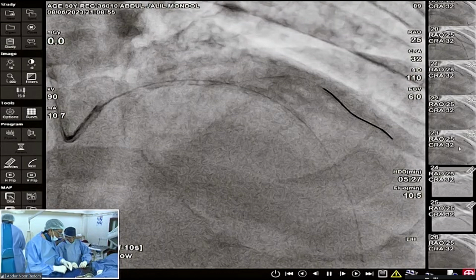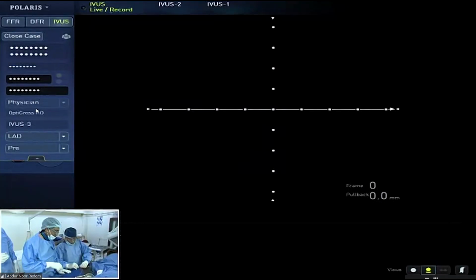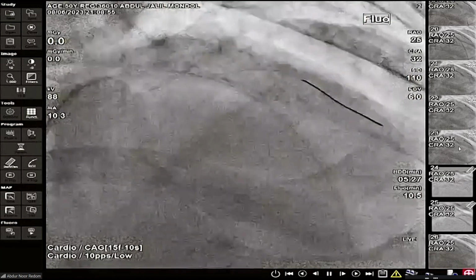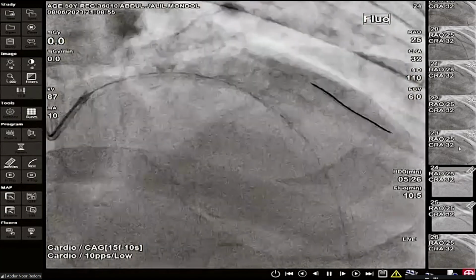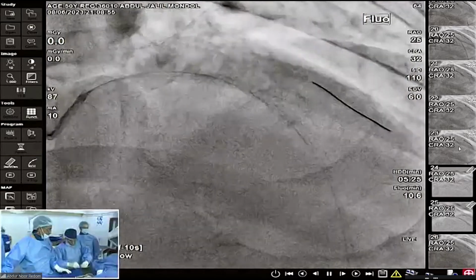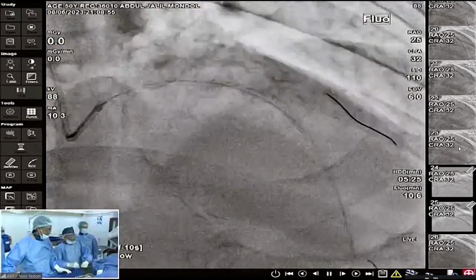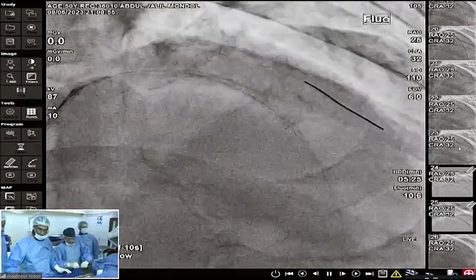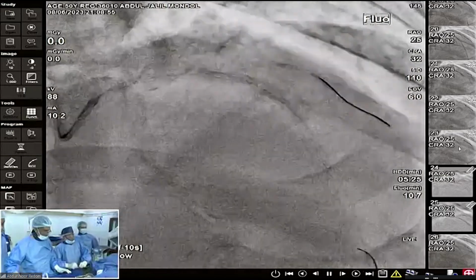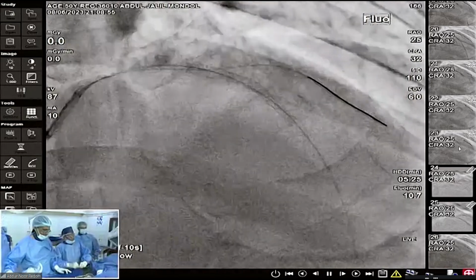One question for the beginners: usually we take an upsized post dilatation balloon. Say your stent is 3, and usually we take 3.5. Why did you take 4? Is there a rationale? Dr. Noor Alam, as you know, we have not gone distally. Just the proximal part we have inflated with the 4 balloon. Then we are checking with IVUS. According to the result of the IVUS, we shall go with a further 3.5 balloon if necessary for the distal part.